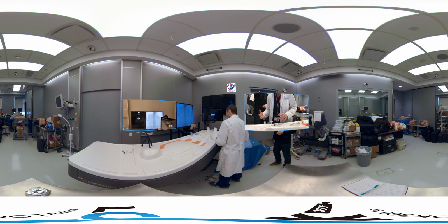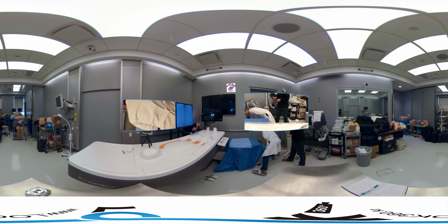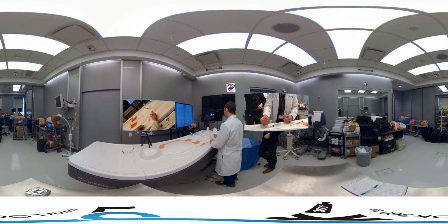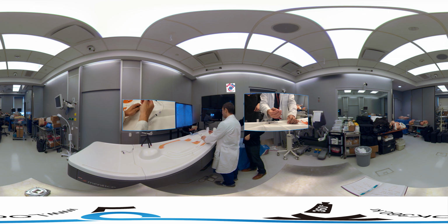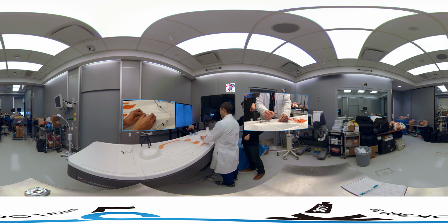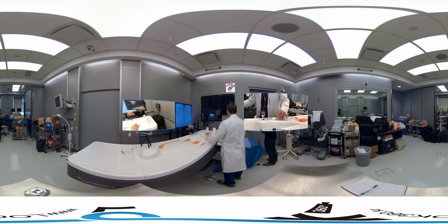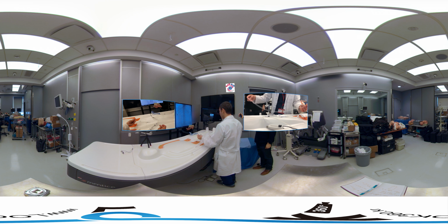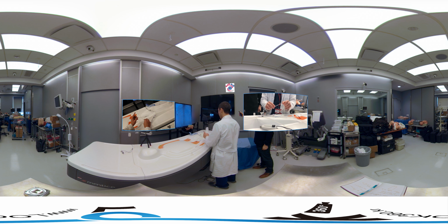So now we're going to load the filter, and what we'll need is the cartridge for this. The cartridge, for this specific filter, has both a jugular and a femoral orientation. Since we're doing it from the femoral, we want the femoral side pointing towards the patient. We'll snap it in. That loads the filter. So within this cartridge is our actual IVC filter. Next, it comes with a pusher. You can either use the inner dilator with a wire, or you can use this pusher that has a stabilizing wire on it. We'll insert that into the cartridge.